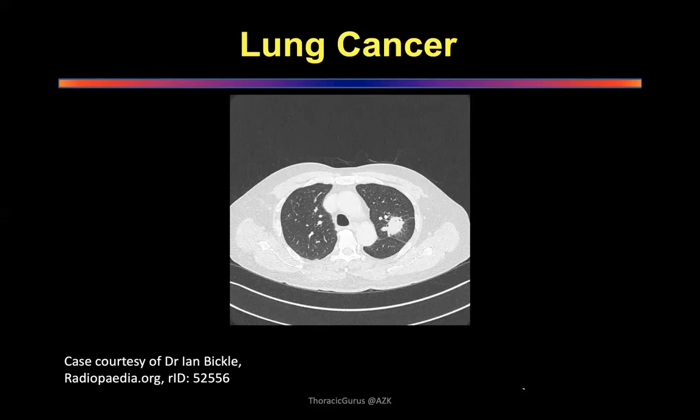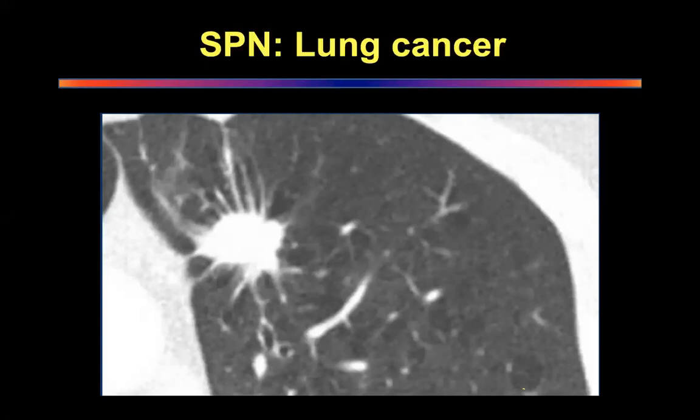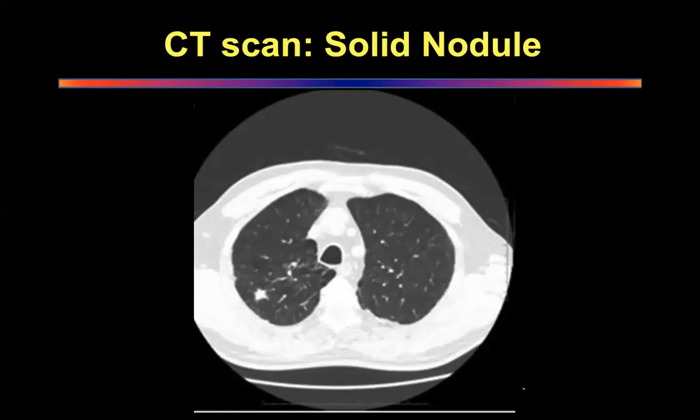All right. Is Abba still with us? Yes, sir. Abba, take this one. So it is a non-contrast CT scan showing a spiculated lesion present in the left lung field, most probably a malignancy, sir. Okay, good. I'm happy with that. Quite straightforward, nothing more.